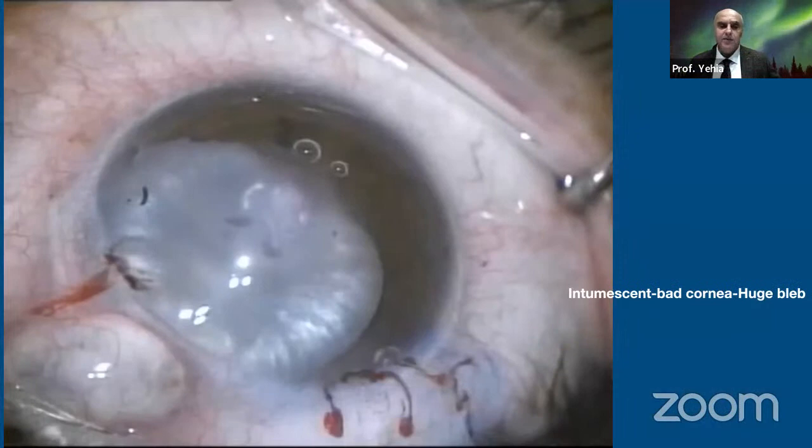This is another example of a huge cystic bleb in a patient who probably had a sector iridectomy for some reason, and he has an intumescent cataract, central corneal opacity, and the iris here is adherent to the back of the cornea. So this is one of the cases that can come to you presenting for cataract surgery, but there are so many challenges here.